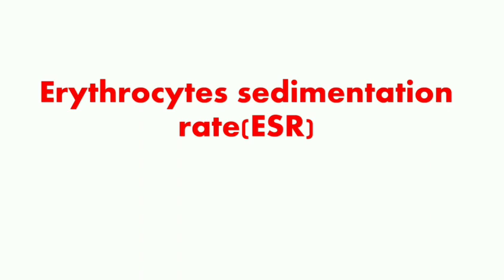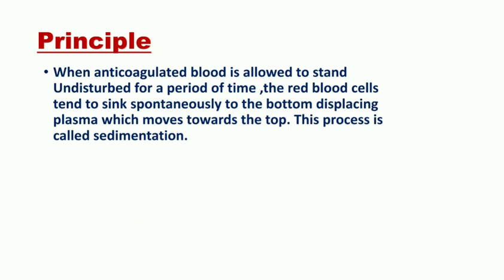In this video, we will learn about erythrocyte sedimentation rate, also known as ESR. Here we discuss the principle of ESR, its stages, methods to determine ESR and its normal values. First, moving towards the principle.